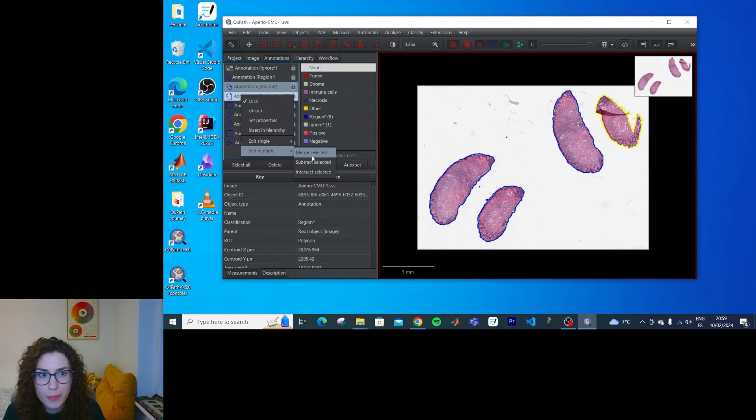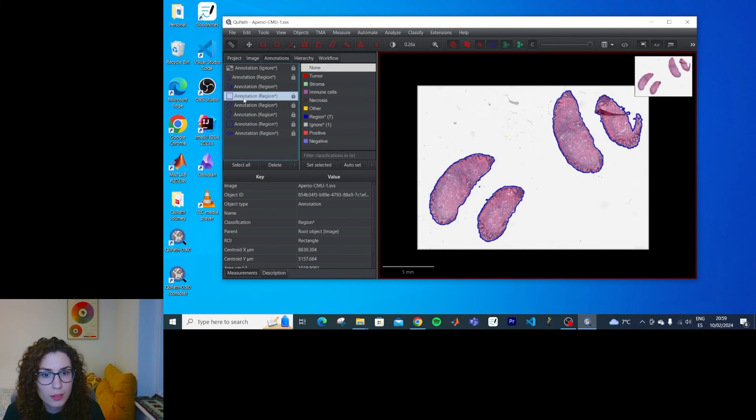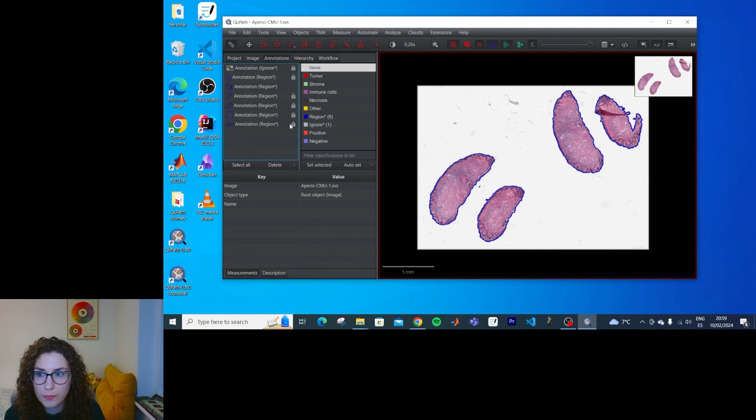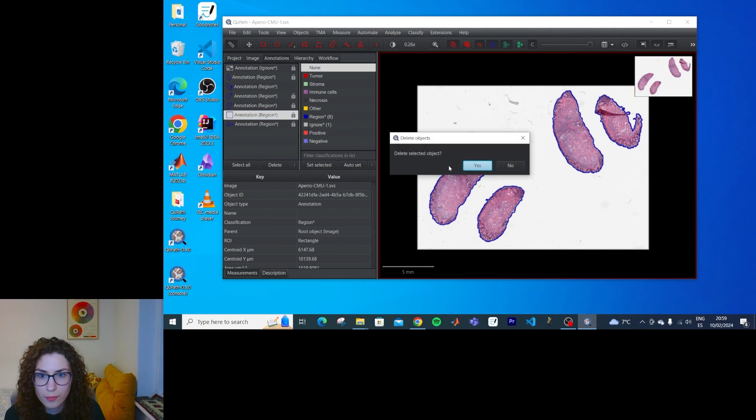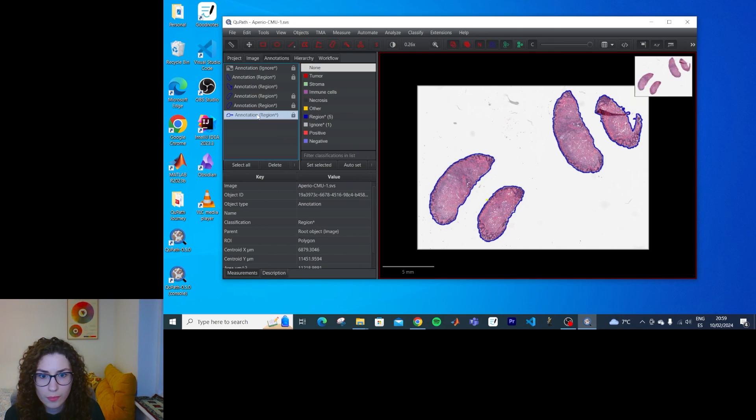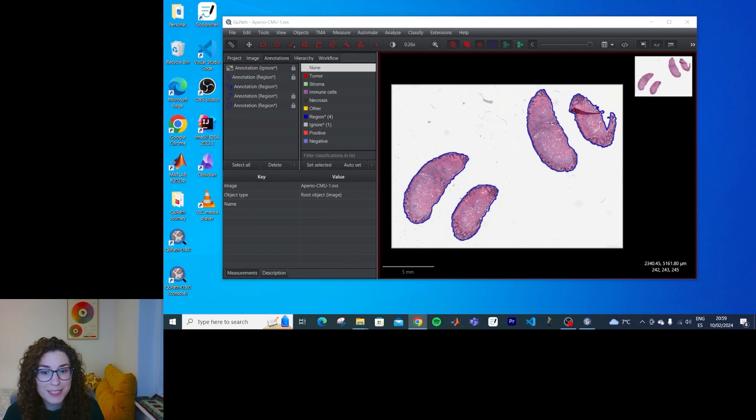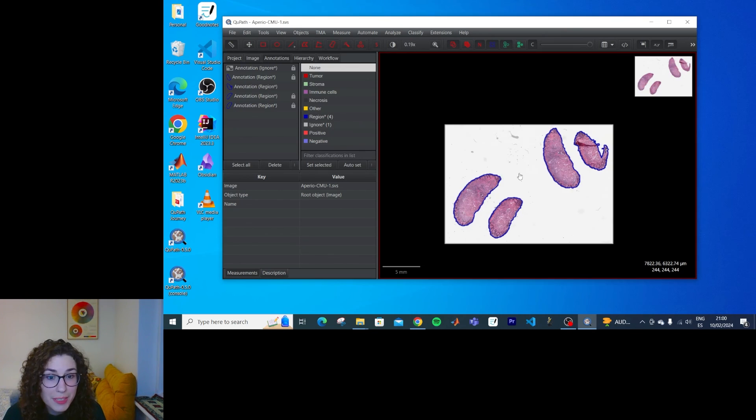And I can merge them as well. Where is this one? Okay, so now I have different annotations for each of the pieces of tissue that I have in this image.